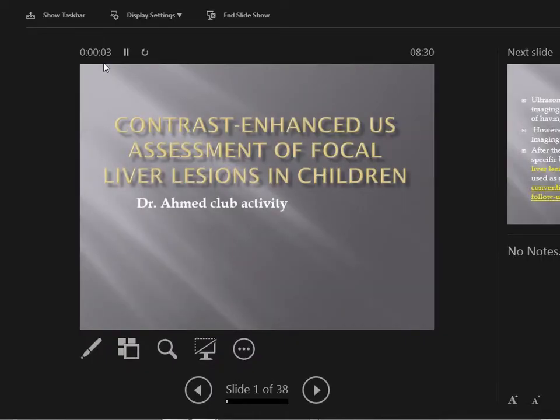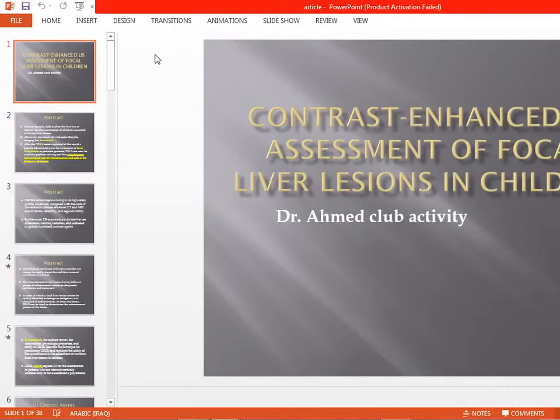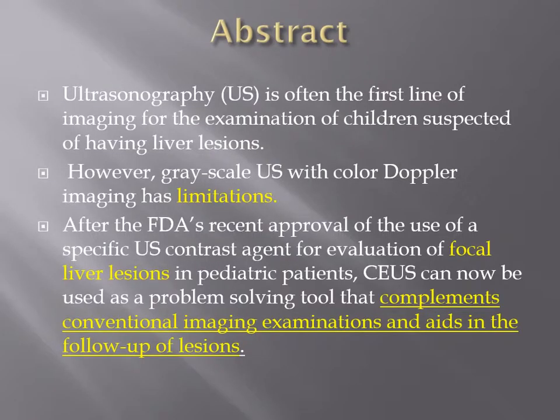Okay, so now we'll continue with the contrast enhanced ultrasound assessment of focal liver lesions in children. Contrast ultrasound is a very unusual topic, so we need to pay close attention to it. It's not available here, but we can ask for it if we want. It's not that big a deal.